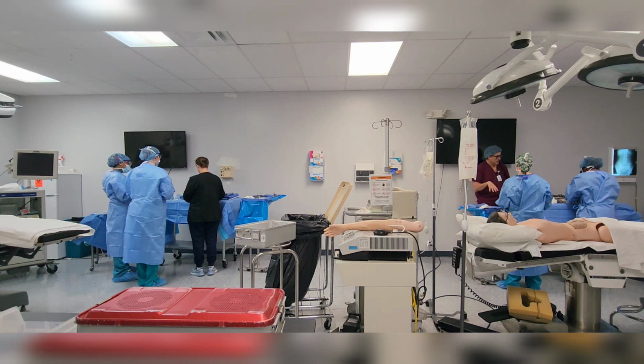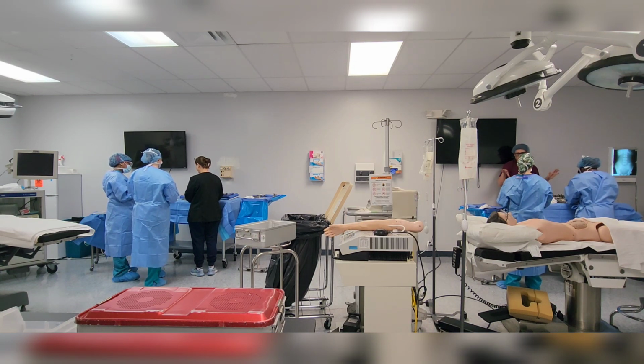Sponge stick. So the idea is organized, not chaos. You take it and fold it, and I keep this organized through the process, so that the final count's gonna be proper. If it just comes unfolded everywhere, it's gonna be hard to track.